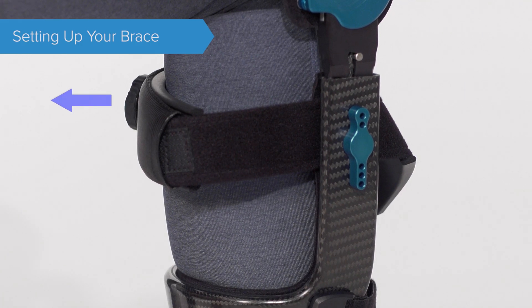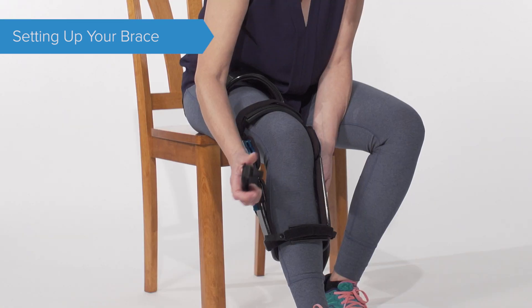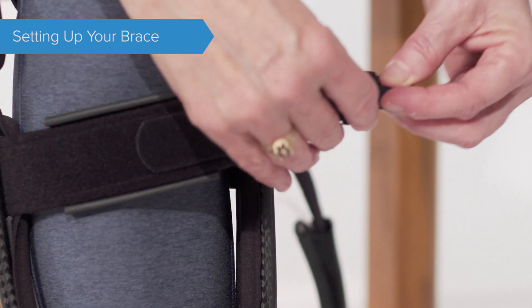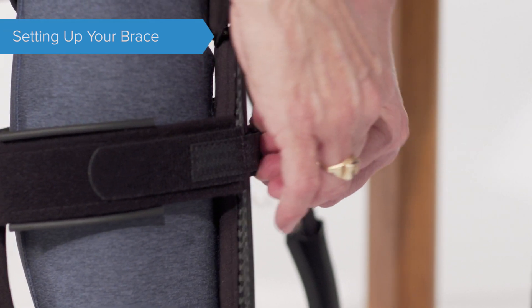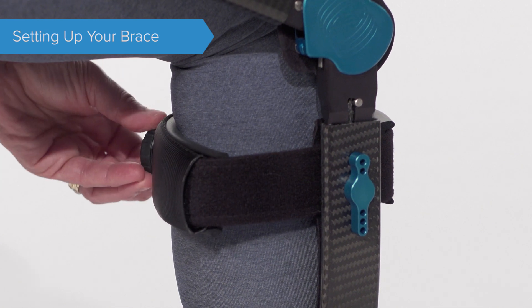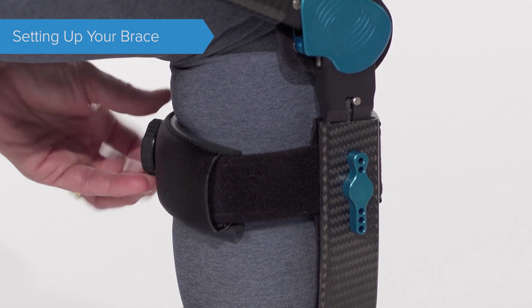Make sure the tensioning knob on the back of the strap is pulled out. Position the strap over your leg, pulling to lengthen if needed. Place on the top of the quick release clip and push down to fasten. Push in the tensioning knob and then turn clockwise to tighten until comfortably snug.